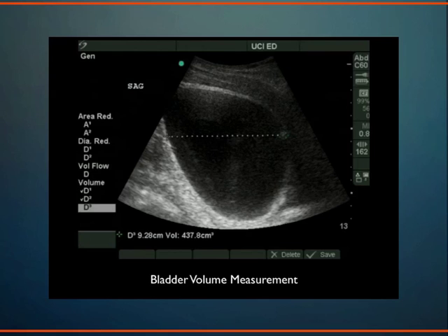like a urologist. And we can also measure their prostate on bladder ultrasound. So on transabdominal bladder ultrasound, we can measure the dimensions of the prostate. So measuring the prostate and having that post-void residual is useful in many different locations, whether you're in the outpatient clinic, the ER, or the ICU. Those are all good information to have about your patient. Does that answer your question?